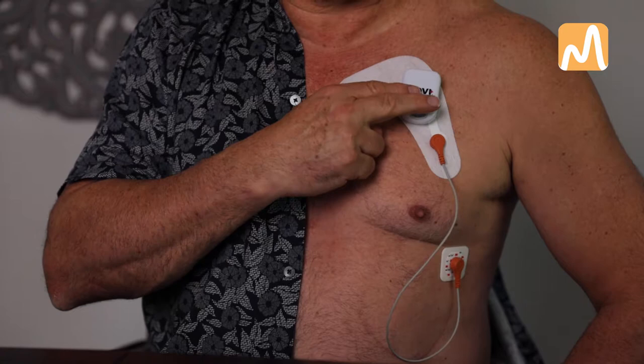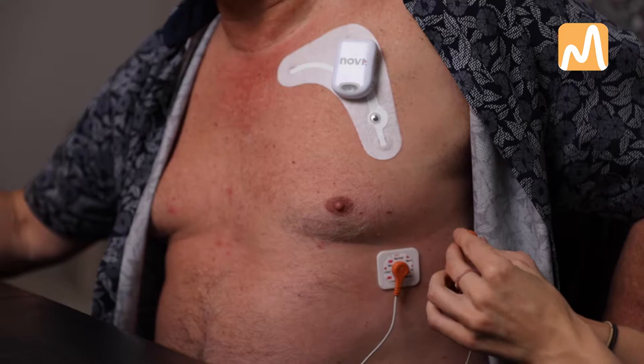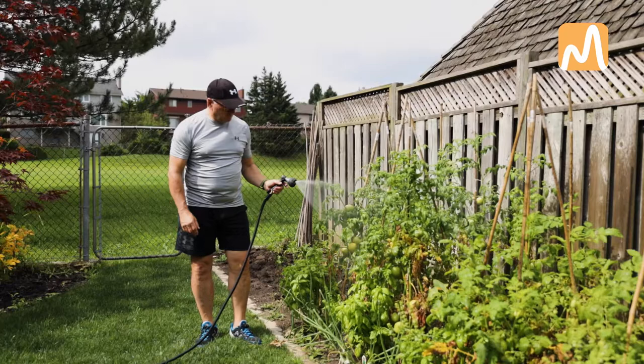In this video, we will demonstrate how to use this device. Your physician has applied a Holter patch. This test will record your heart's activity. It is designed to remain on your skin for the duration of the time your doctor has prescribed.